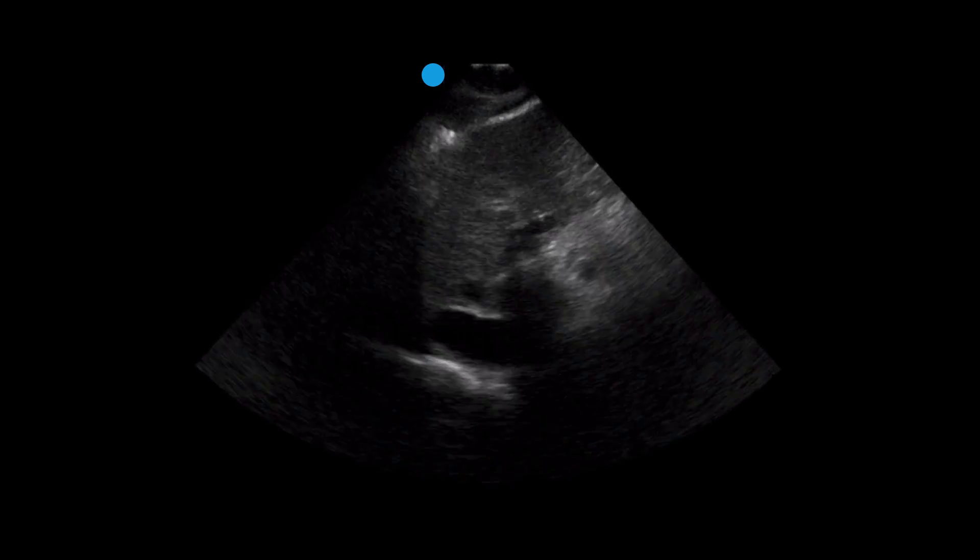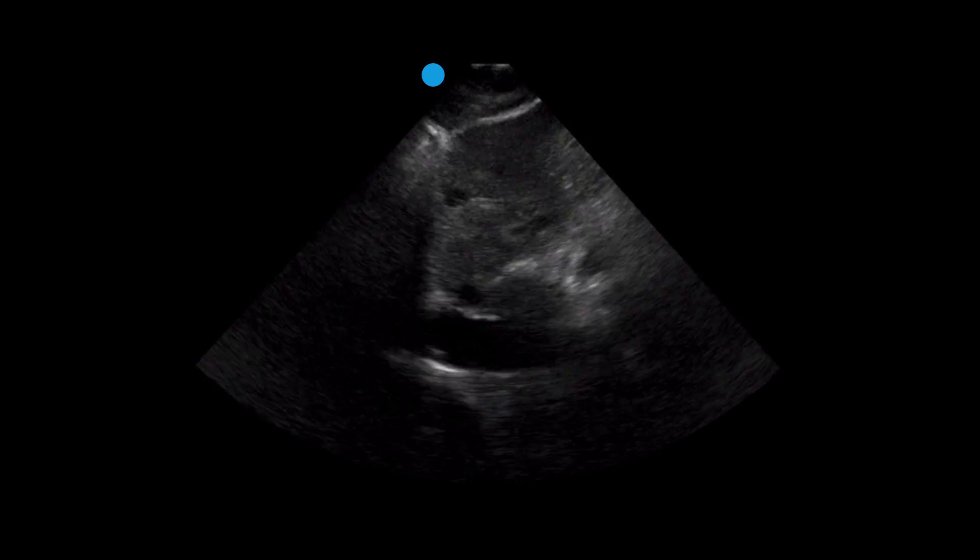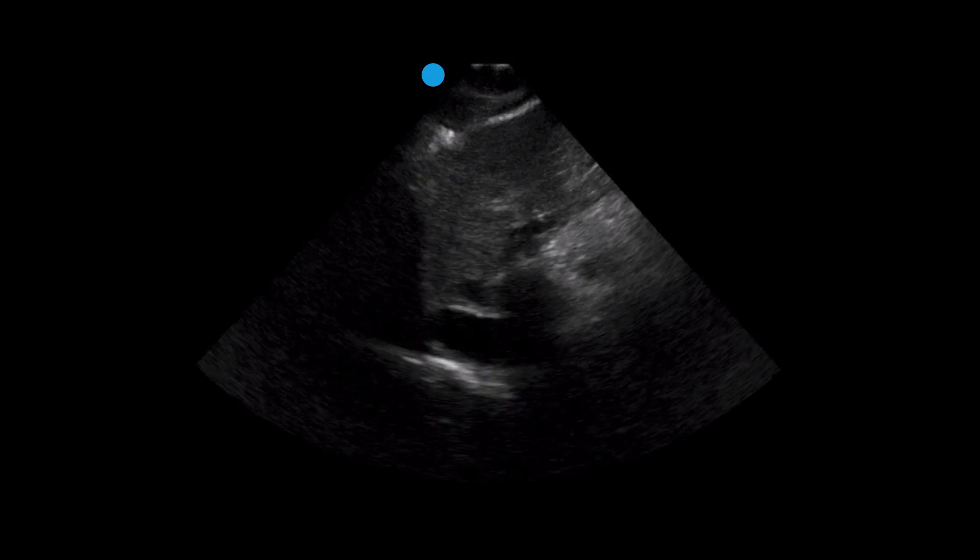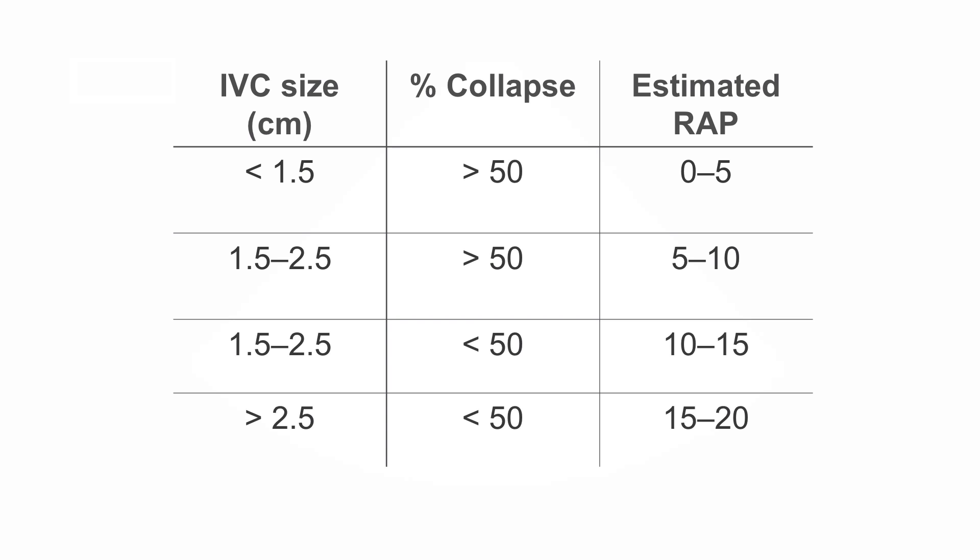We'll obtain an image of the patient's IVC. In this case, we can see that it's dilated and it's poorly collapsible. And then we'll freeze the image and obtain a measurement. It measures 2.18 centimeters. We can see then that this patient had poor collapse and an IVC of 2.18 centimeters, which puts the estimated right atrial pressure at 10 to 15 millimeters of mercury.